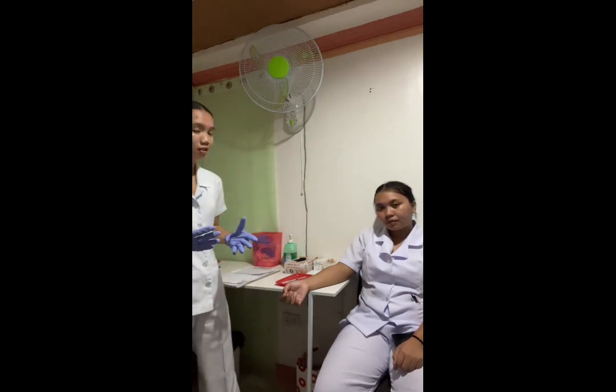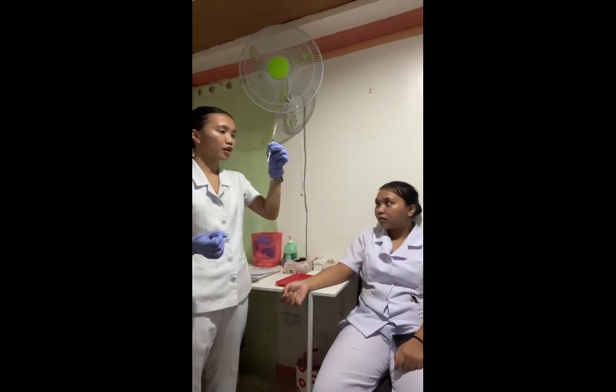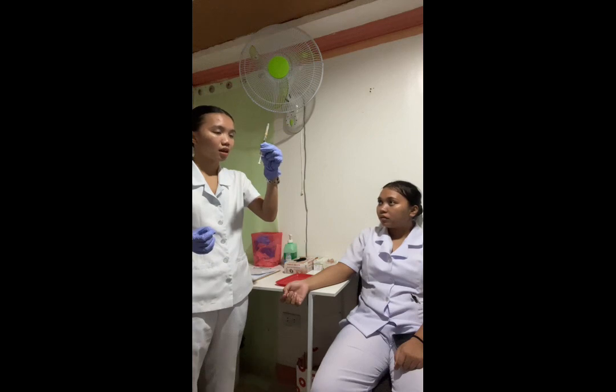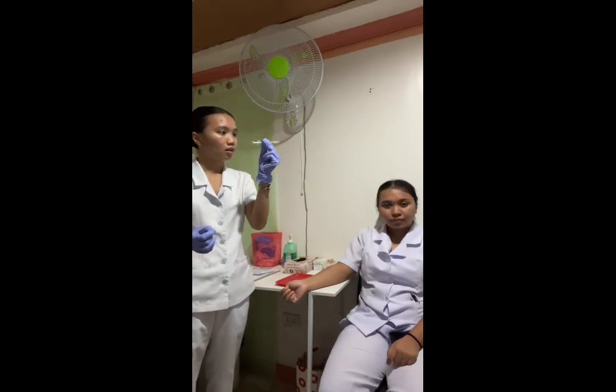And then we have to expel any air from the syringe, because small bubbles adhered to the plunger are of no consequence, because a small amount of air will not harm the tissues. So upon checking, there are no bubbles or air inside the syringe in which the medication is being stored. And then we are going to grasp the syringe in our dominant hand close to the hub, holding it between the thumb and forefinger.